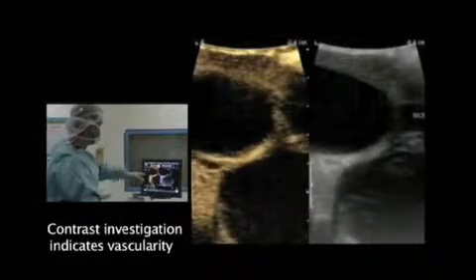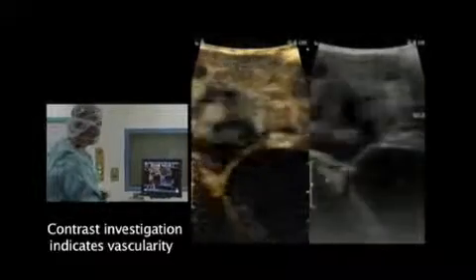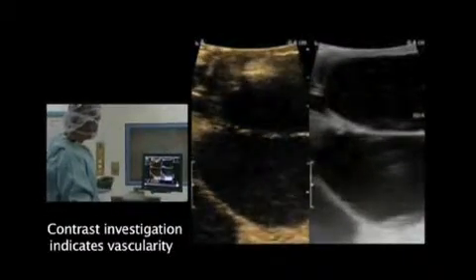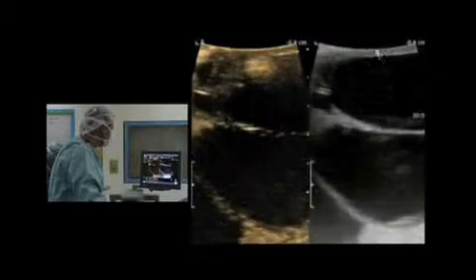The cyst will of course remain dark and without any flow, and now we can see the vascular structures, and that is why I also want to evaluate the structures of the septa. For instance, between here we have to face that there is actually a vascular structure between these two. On the other hand, between these two there is not a vascular structure. So it can provide us quite important information.